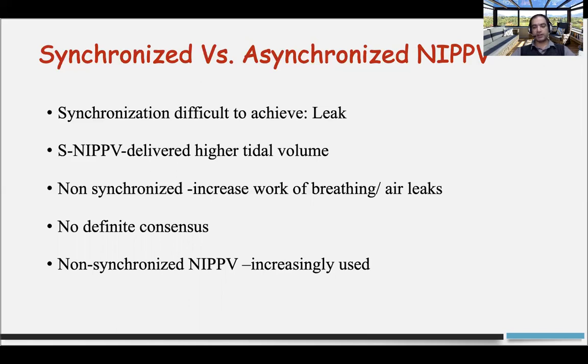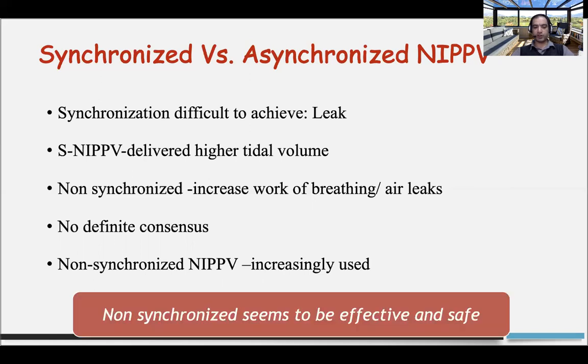Although various studies have shown that the synchronized form of NIPPV leads to better tidal volumes, only 15% of the babies have actually been shown to get higher tidal volumes. Also, non-synchronized NIPPV has been increasingly used around the globe, and it has been shown to be beneficial. So as of now, there is no consensus regarding which one is better. Both can be used if available. The synchronized form should be preferred, but the non-synchronized seems to be effective and safe.